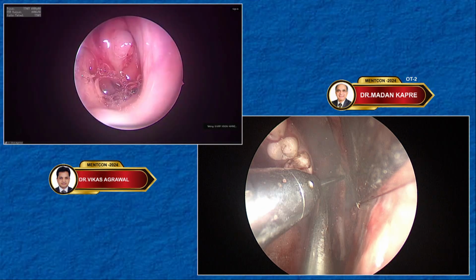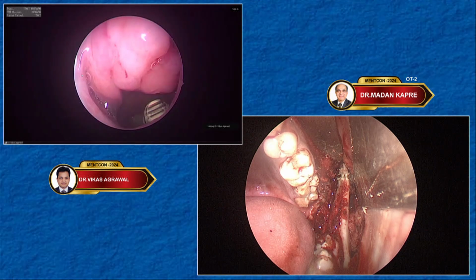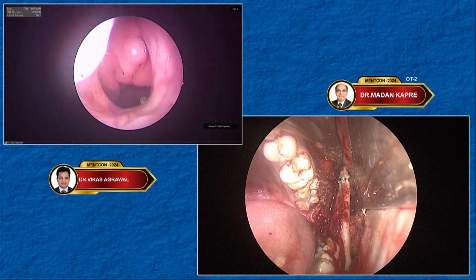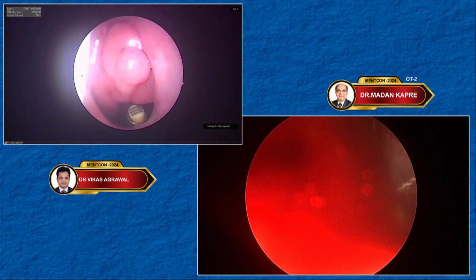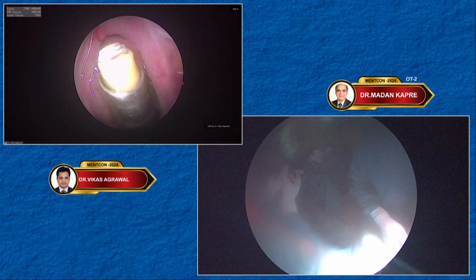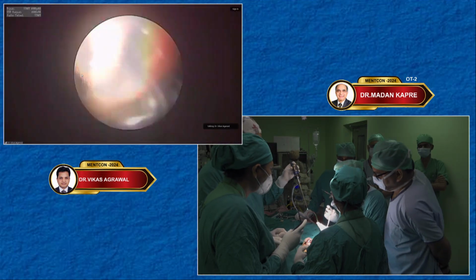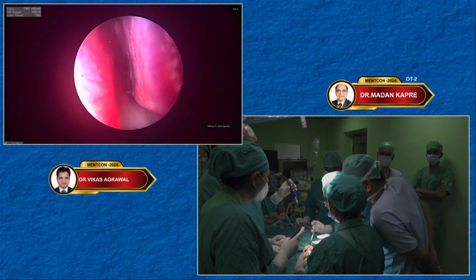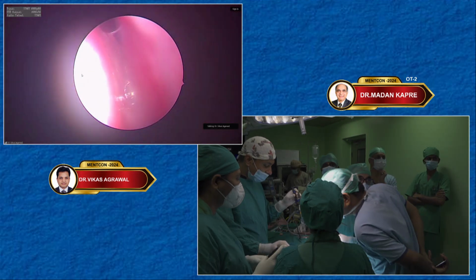Yes, we can see. All right. So, see, this is the adenoid. I have pulled the soft palate with the rubber catheter. Therefore, you can see some space. And we have already given some oral steroids to the patient so that the size of the adenoid and the vascularity has already come down. But still, you can see this is almost a complete block. Let me show the other side as well before I start.